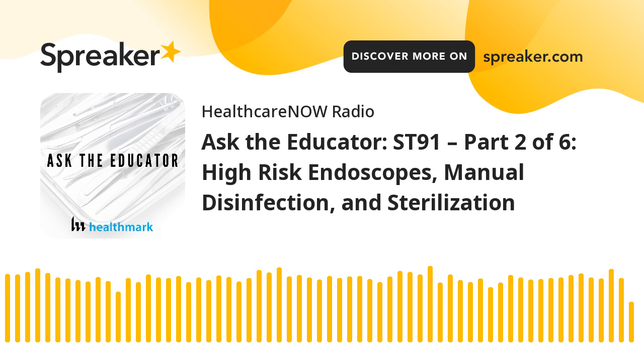But in addition to that, that inventory list gives you the opportunity to look at them and see which are already compatible with sterilization. When I started in this industry back in 2009, there were many surgical flexible scopes that were already compatible with sterilization at that point, although not widely used. So your first step is to identify which of those are already compatible. I will tell you those are mainly your bronchoscopes, ureteroscopes, cystoscopes, some ENT scopes, the surgical flexible scopes. That's your low-hanging fruit to transition to sterilization.